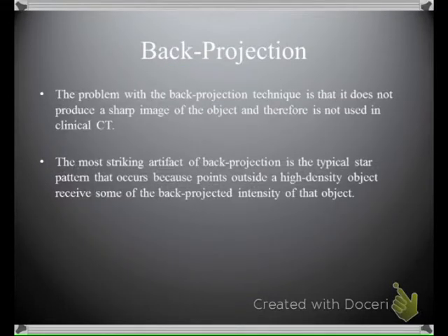And the problem with this, and you need to put a star by both of these bullet points, is that the back projection technique does not produce a sharp image. That's one of the things that we strive for in CT, producing sharp images that are excellent in diagnostic quality, and back projection simply does not do that. And so the ultimate thing is that it's not used in clinical CT.